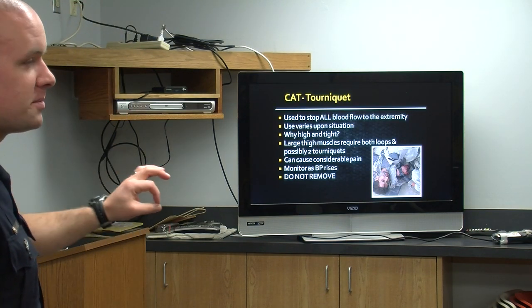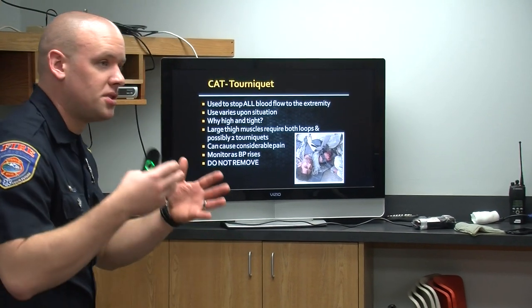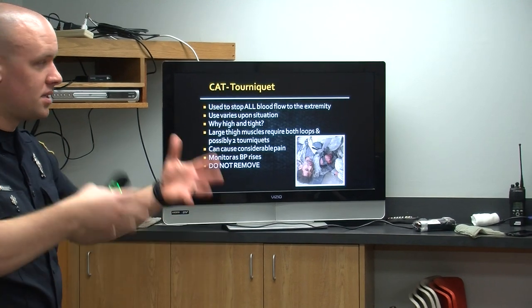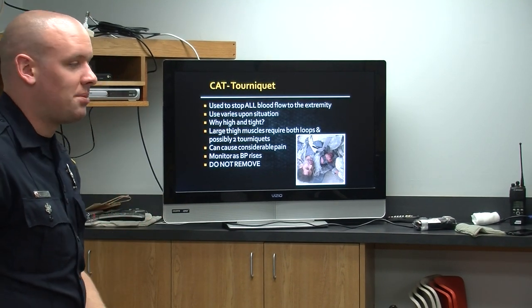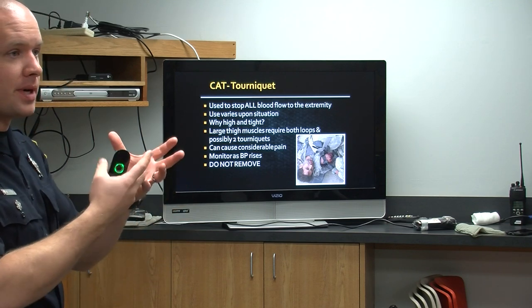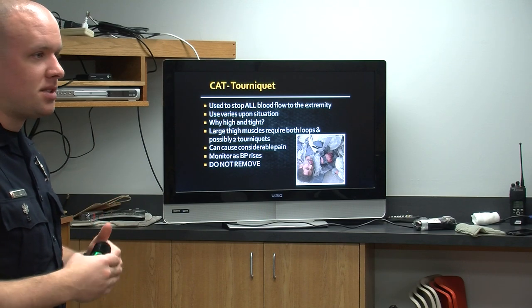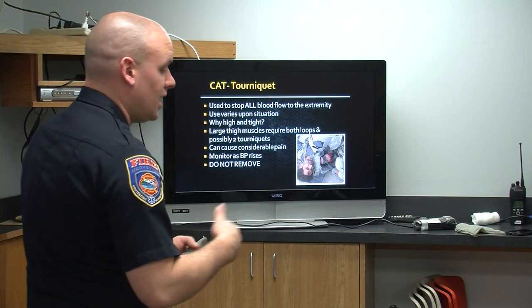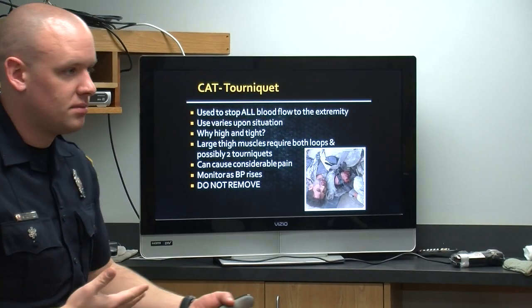As their blood pressure comes back up, you have somebody with a significant leg wound, they've got bleeding, their blood pressure initially is going to drop. So their body can start to control what's going on. As you put that tourniquet on and you stop that bleeding, their blood pressure will start to recuperate and rise. So just watch that wound that it doesn't start re-bleeding. As their blood pressure gets back up near normal, if it starts re-bleeding, tighten it down a little bit more. Stop the bleeding and go from there.